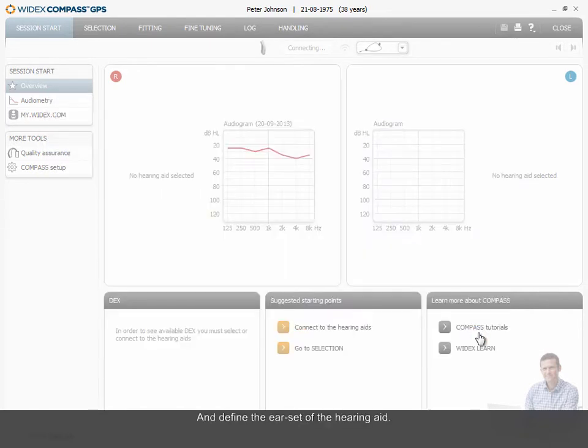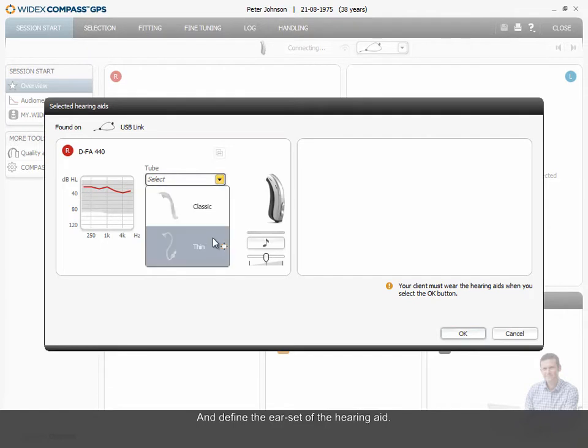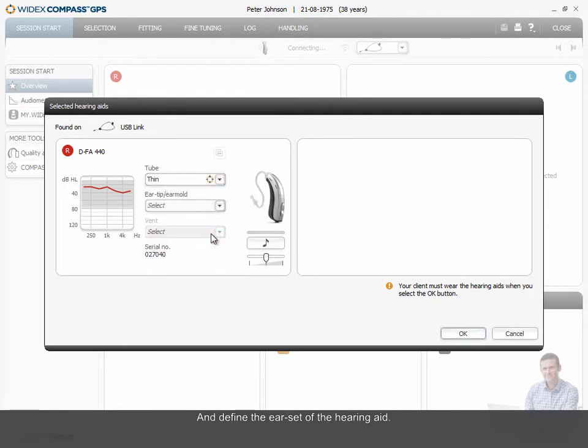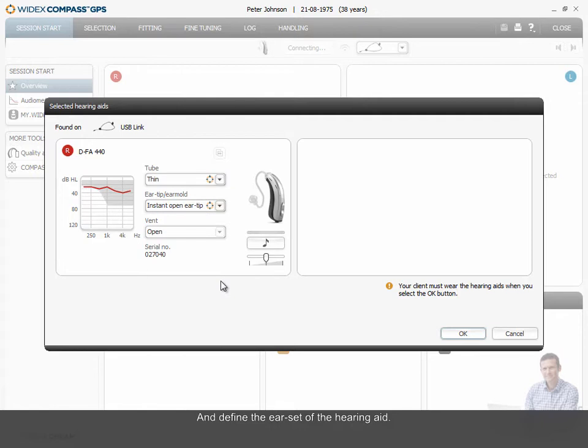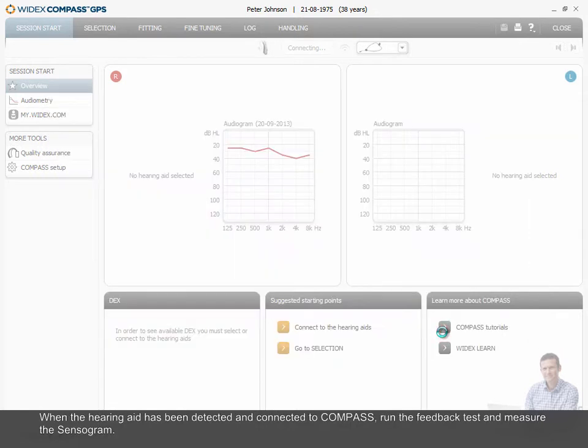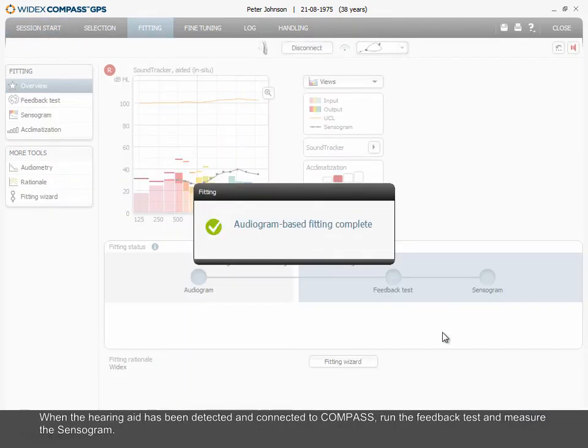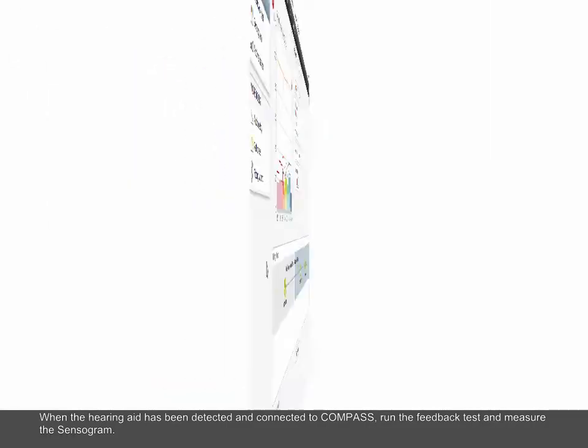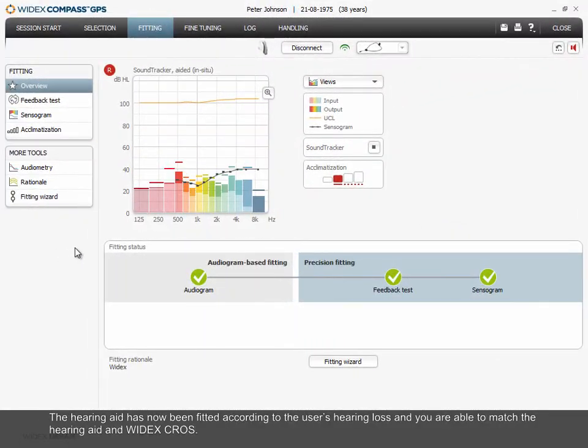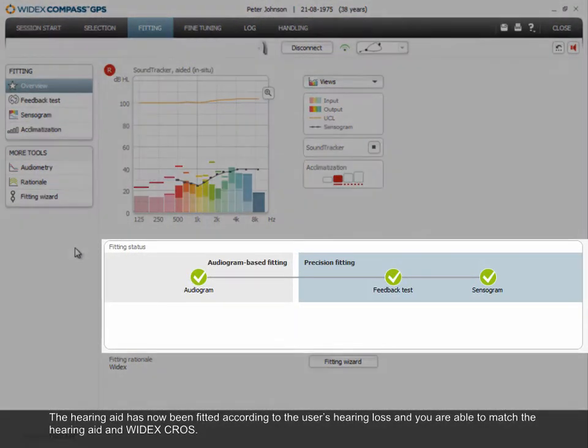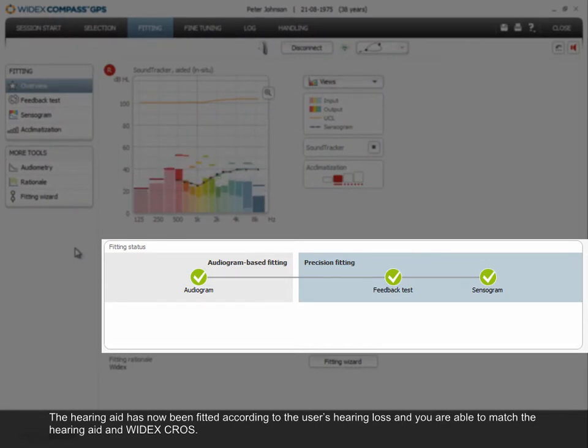And define the ear set of the hearing aid. When the hearing aid has been detected and connected to Compass, run the feedback test and measure the sensorgram. The hearing aid has now been fitted according to the user's hearing loss and you are able to match the hearing aid and Widex CROS.